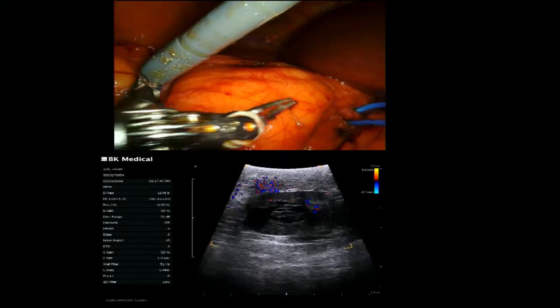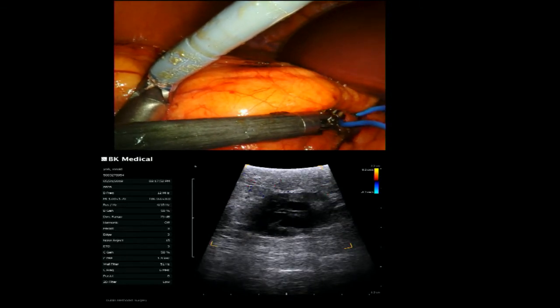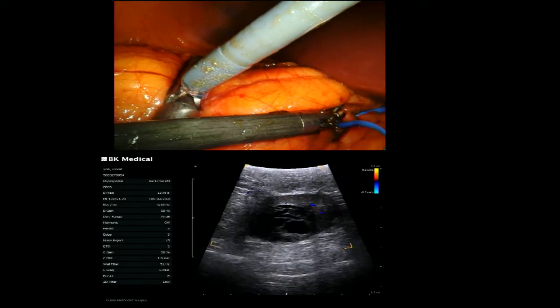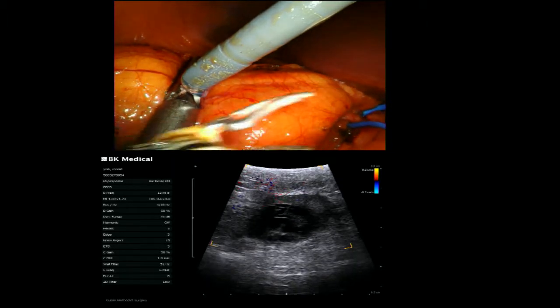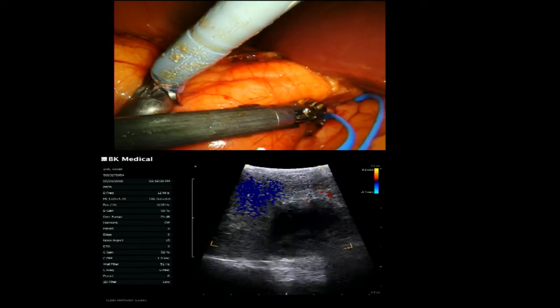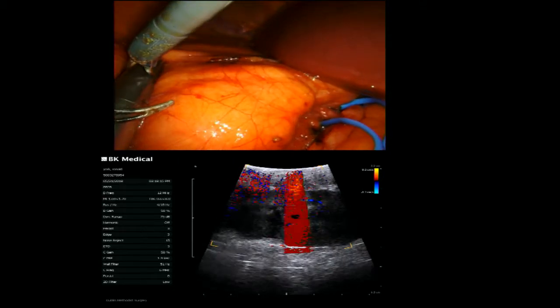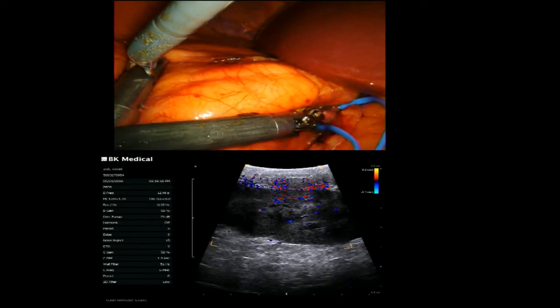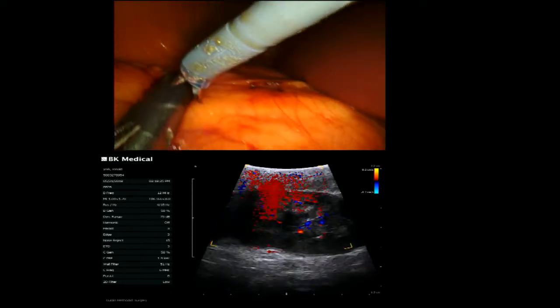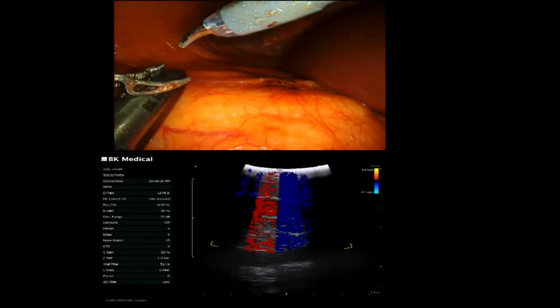The other option we can do, too, is more than the vessel loop, we can actually pinch the artery. And that gives us even better occlusion, so you can see that's even better. Yeah. So that makes me feel better that that is the artery, even though, again, it looked very different on the scan. Rotated there. So obviously this thing is made to be used with the ProGrasp, with this little notch right here, but I don't use the ProGrasp, so I'd have to waste an instrument life just to do the ultrasound, so that's why I just kind of make do.